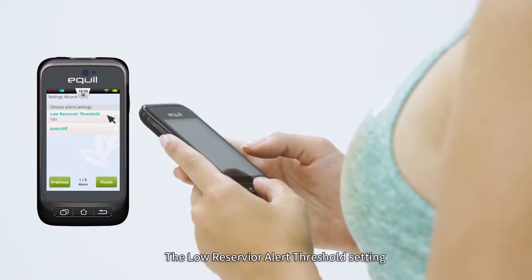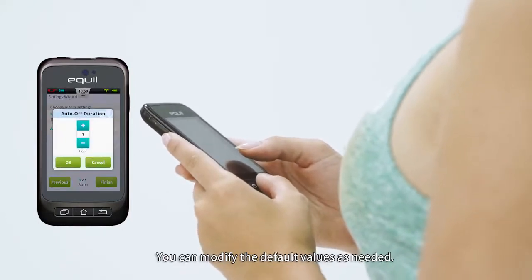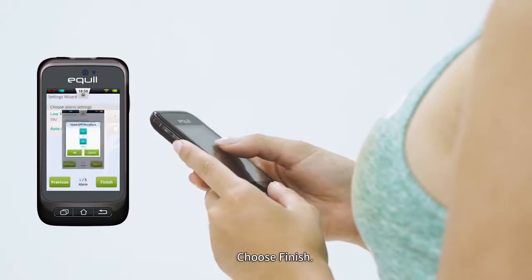The low reservoir alert threshold setting, the auto off. You can modify the default values as needed. Choose Finish.